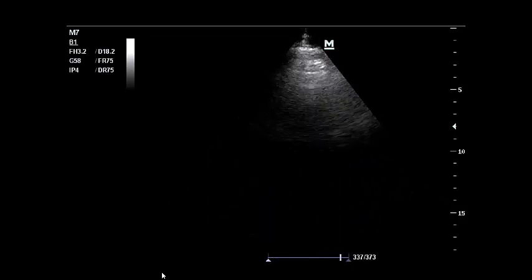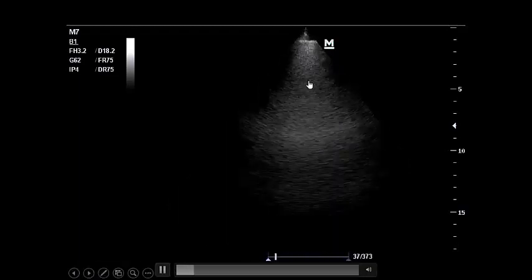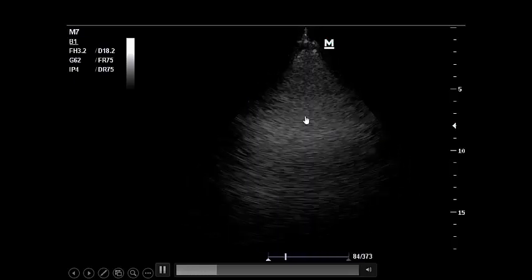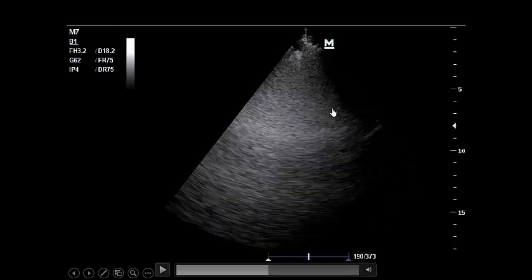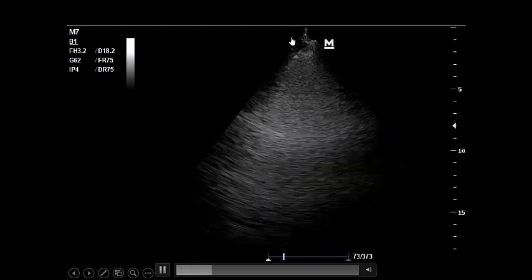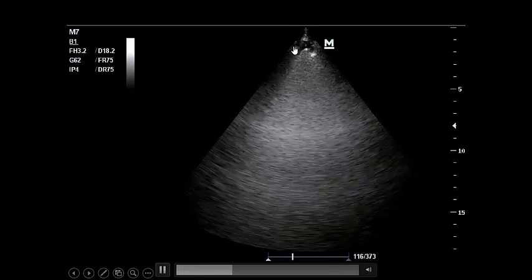What else? This is dense B-line coming from the pleura, like a curtain. If you see here, subpleural, you will see a hypoechoic region, raised edge, dirty hypoechoic region below the pleura, which is called subpleural consolidation. It is unique for ARDS and interstitial pneumonia. Look for this dirty hypoechoic area. It's going with acute lung injury.